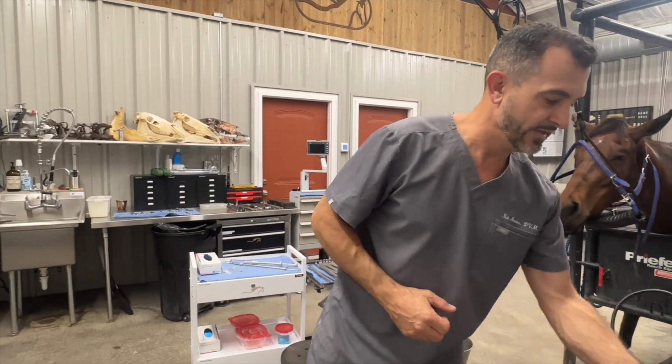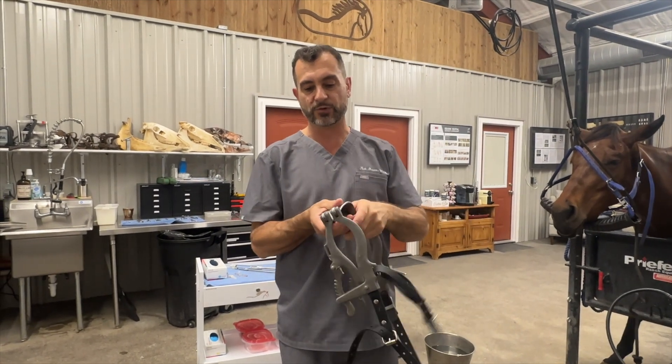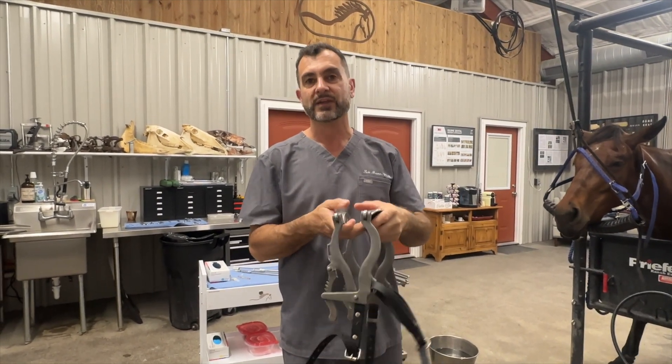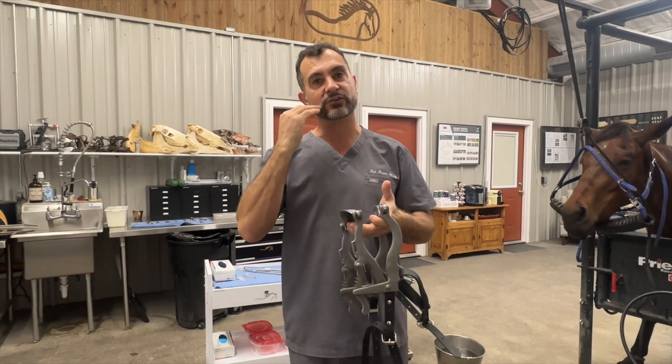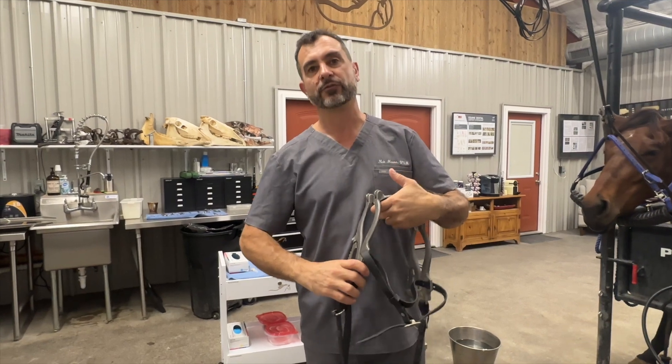The speculum, which is used to do a good oral exam in the mouth, is placed in and opens the jaw slightly. If there's a hairline fracture and we force the jaw open, we're going to make the fracture worse. So the first thing is to rule out a fracture.